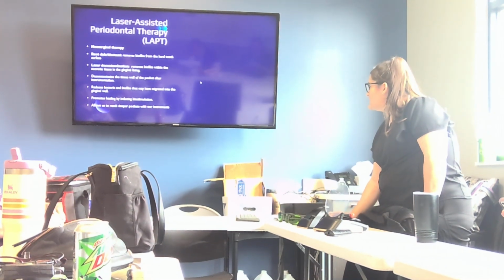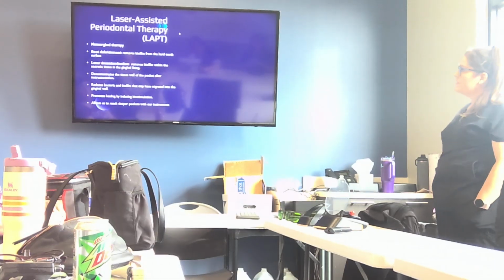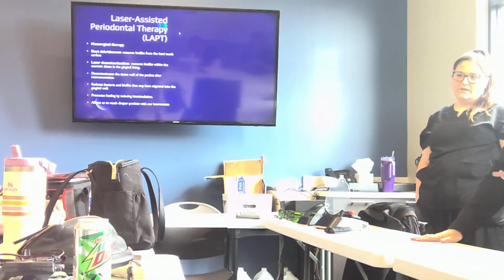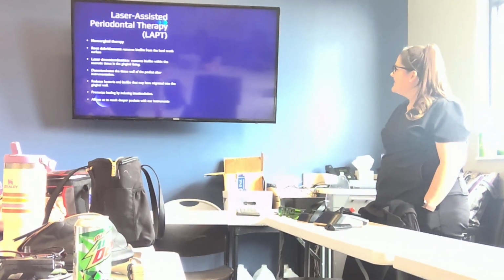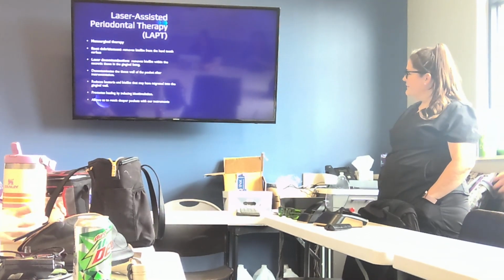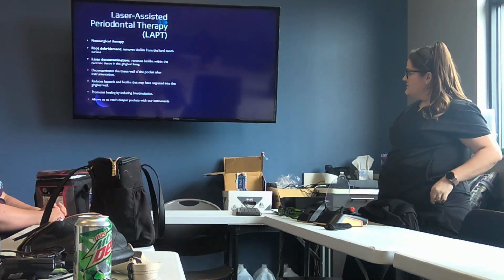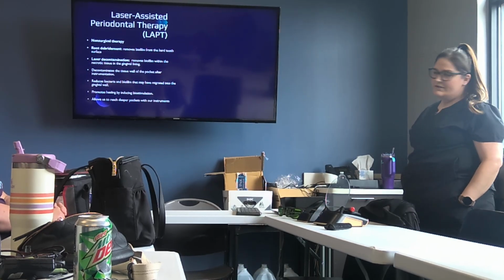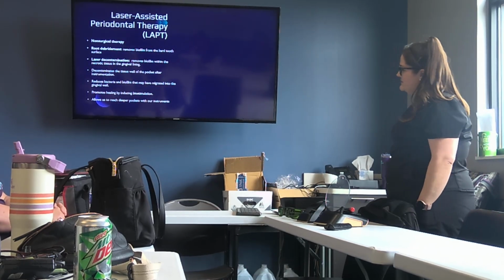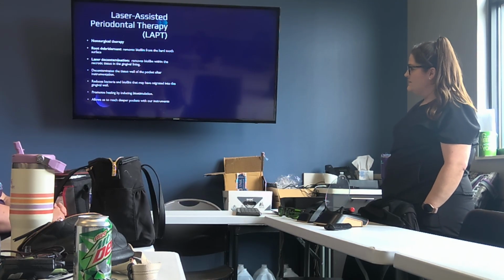And another video on this slide too. So this is where we would integrate it into SRP cleanings for the gum therapy. The laser assisted periodontal therapy. So it's non-surgical therapy. It's used for root debridement, so it removes the biofilm from the hard tooth surface. And then the laser decontamination removes the biofilm within the necrotic tissue.